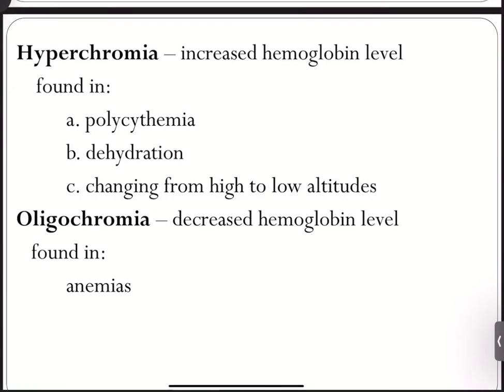Okay. This can also provide us with a background on the patient, especially in the color of the content of the hemoglobin. So for this, hyperchromia or hyperchromasia, increased hemoglobin. Okay, the cell is darker than it looks like. Okay, this is seen in polycythemia vera, no, increased RBCs, okay, and plasma viscosity.